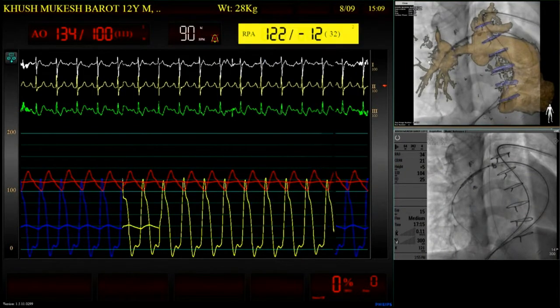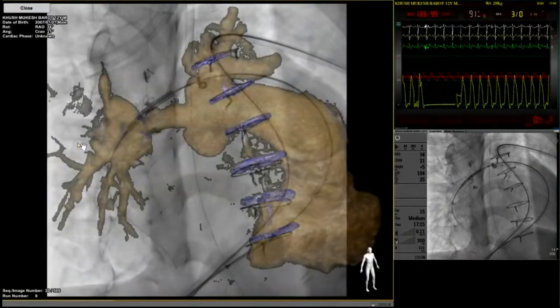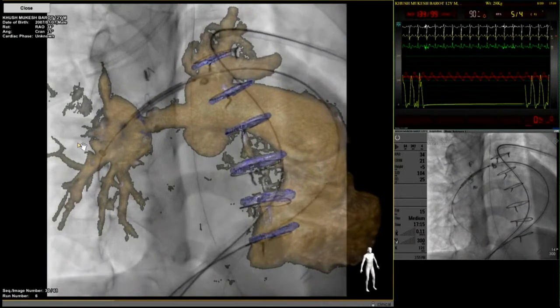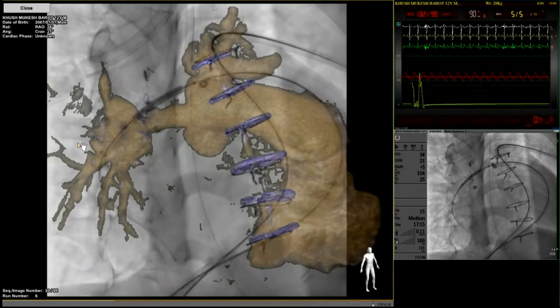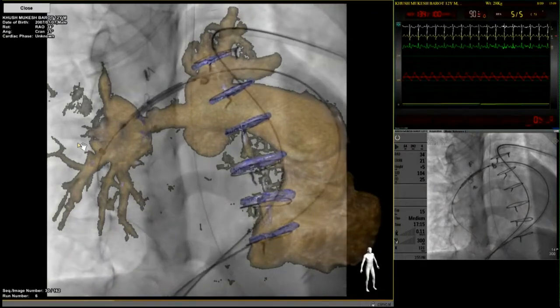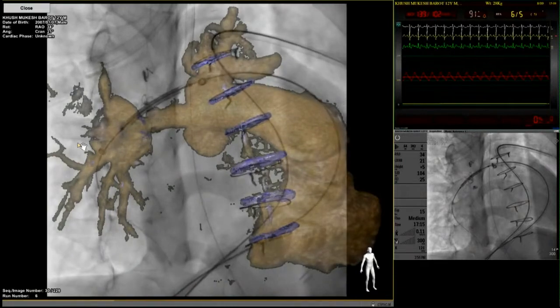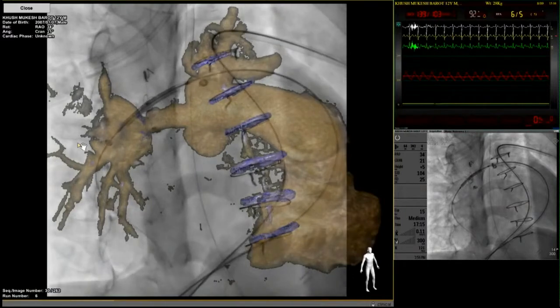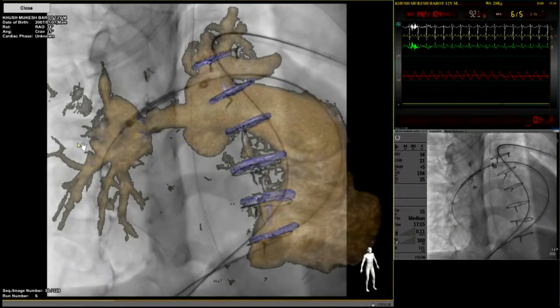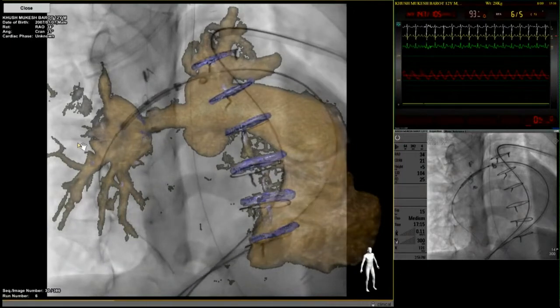Just one question. Are you going to stent that RPA alone now? Or are you going to stent in sequence, or are you going to do both together? No, I'm going to be doing sequentially. You'll do the RPA first. Yeah, RPA first, because RPA was the Gore-Tex tube. So I want to see the worst anatomical lesion first, so that I will have the maximum reduction in the RV pressures with the first balloon. And then within a short time, I will do the next, because already I have a sheath on the left.